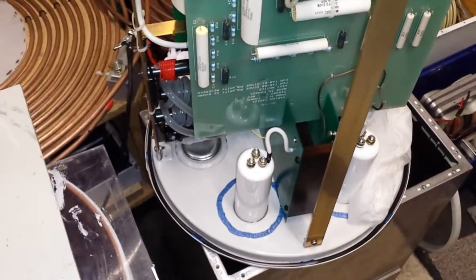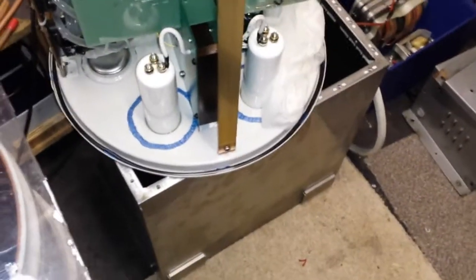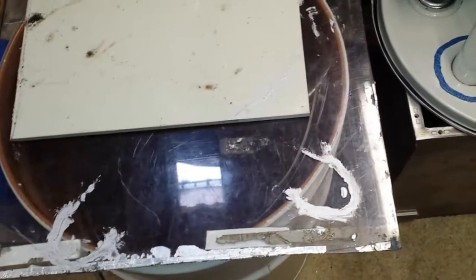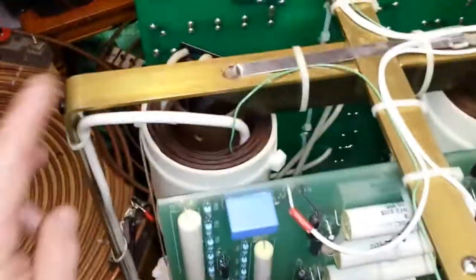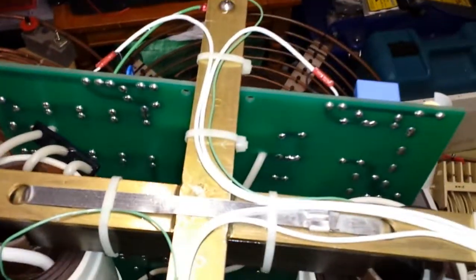And it's probably another design that a company's tried to do. Obviously, it saves costs compared to having something like this built to spec. Something like this is a lot cheaper to put together than having something like that made with a cast lead. So it's obviously down to cost, but it most certainly is a very nice transformer, inverter type, very nice indeed, as it's run on frequency.